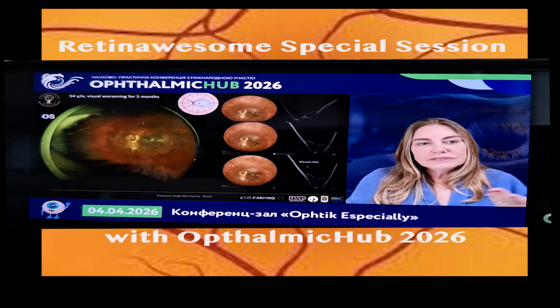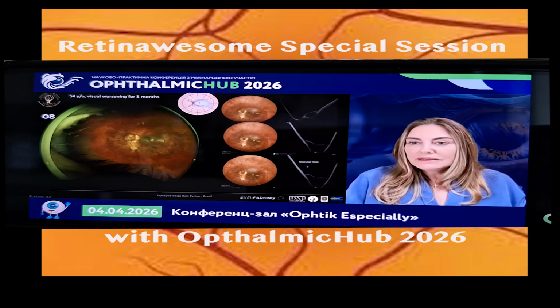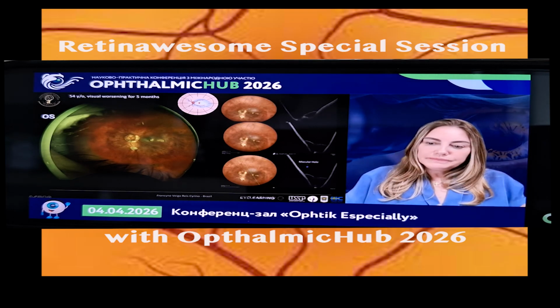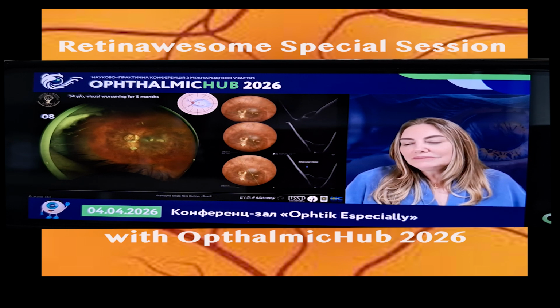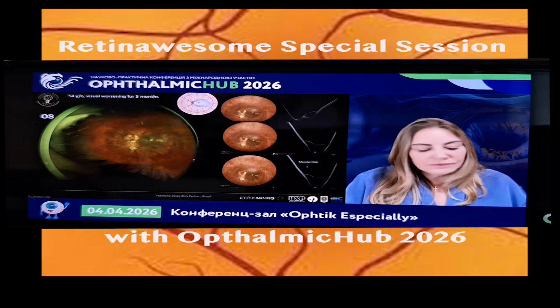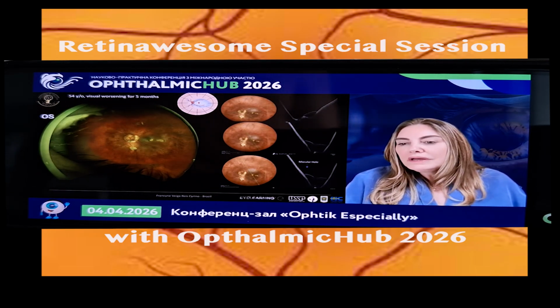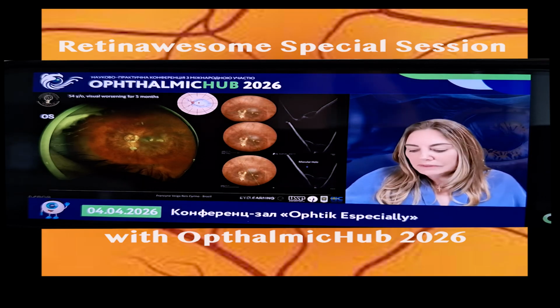But when we are dealing with this kind of anatomy, this big eye, you see here that this eye is very long. This is a swept-source OCT where we can capture almost all of the posterior pole in one image, which is not easy with other kinds of OCT like Heidelberg that we also have. So this is of help. Here you can see a full thickness macular hole and a very big staphyloma, and also this compound form.